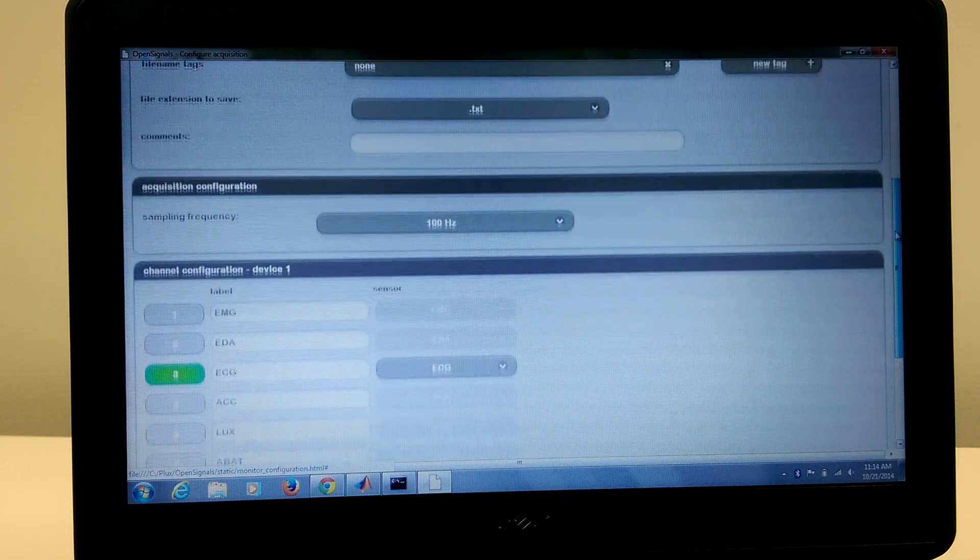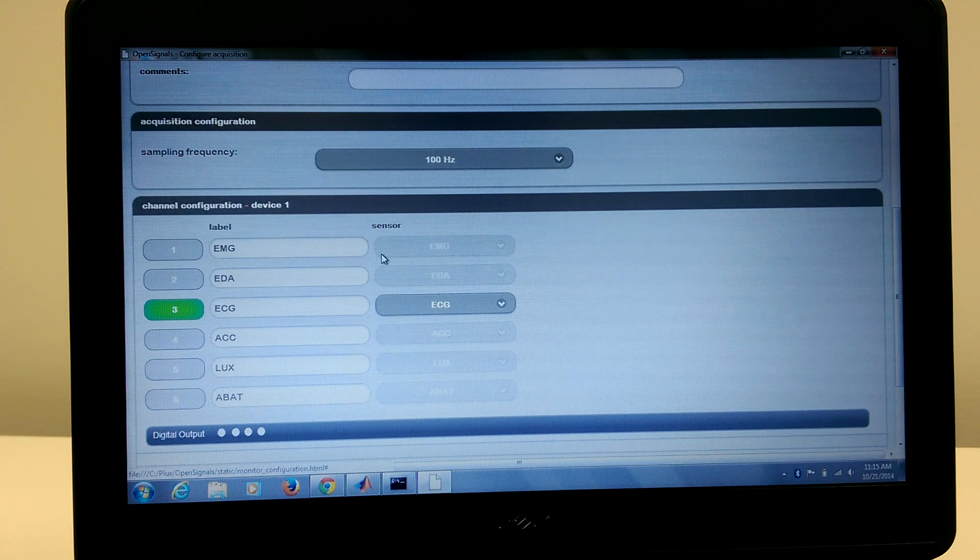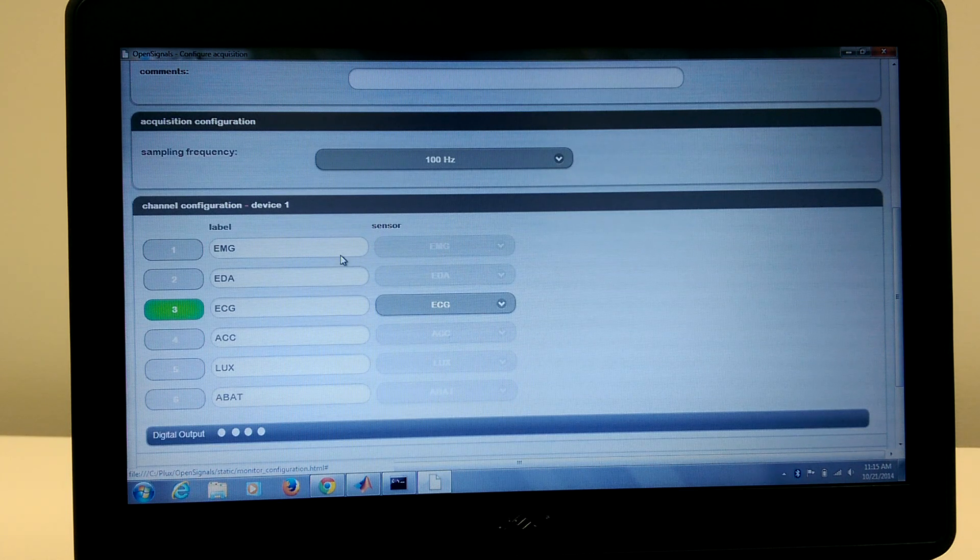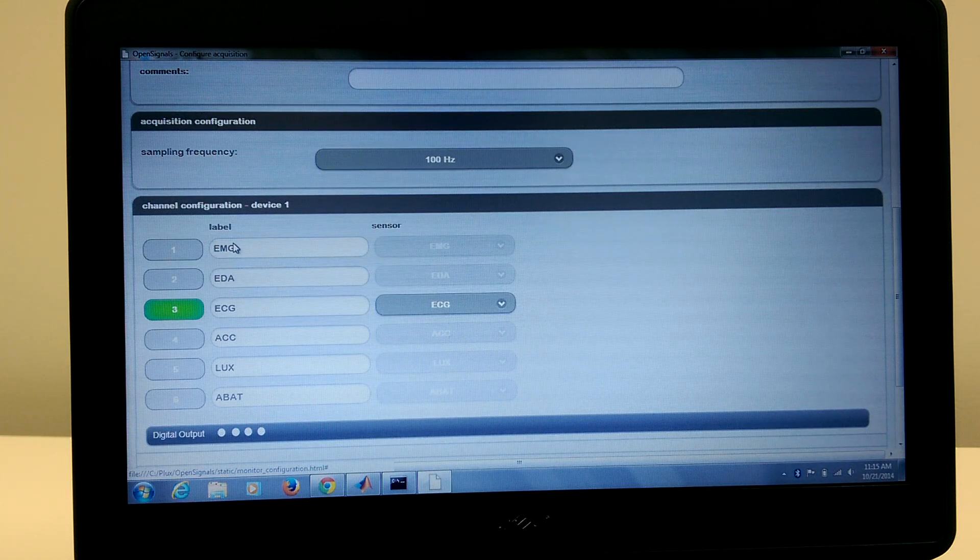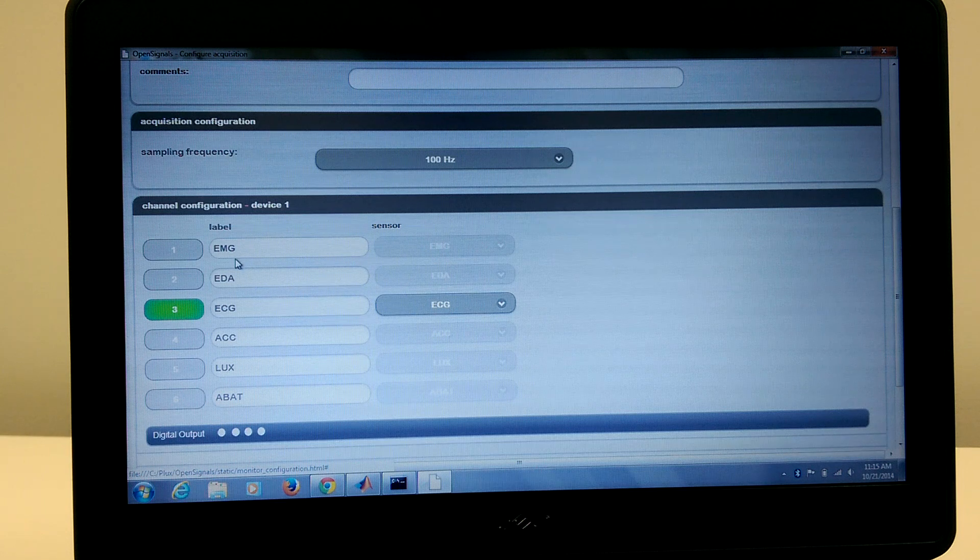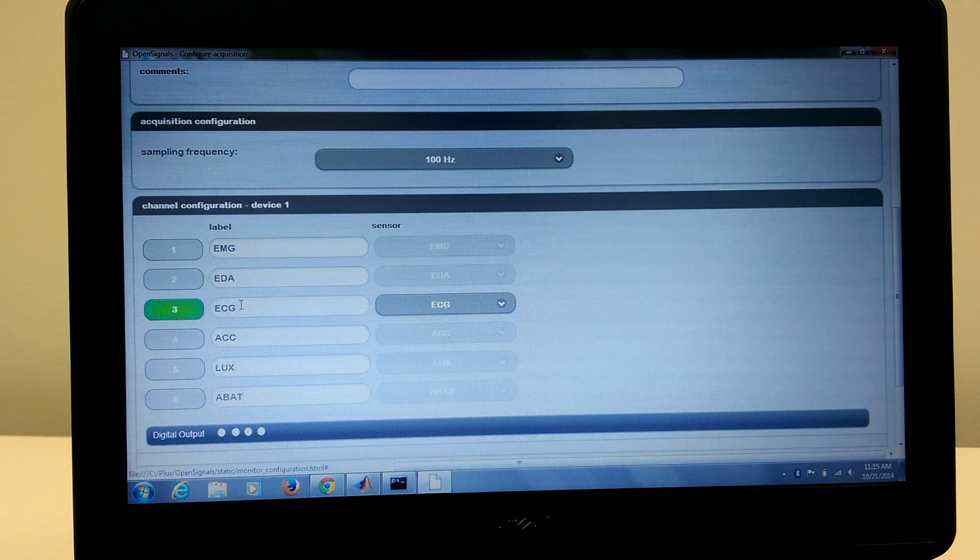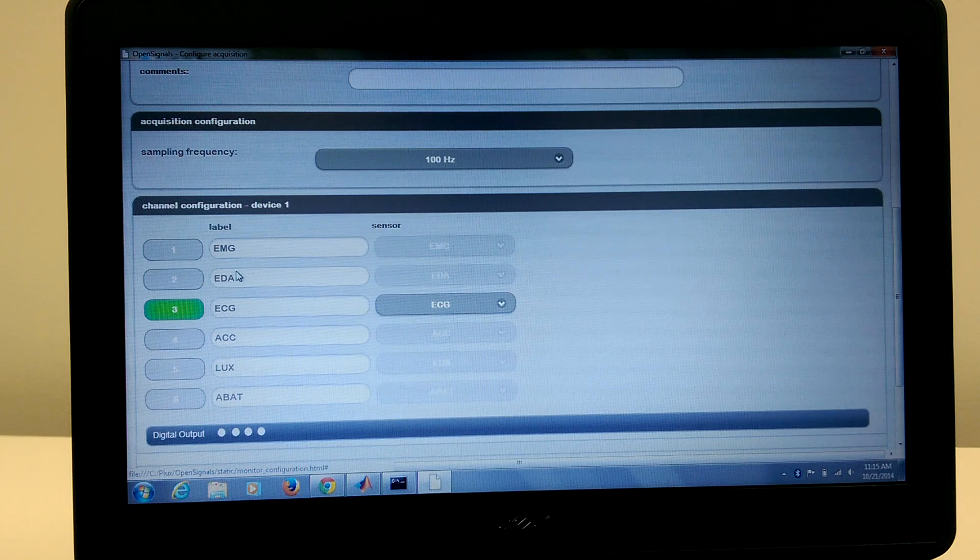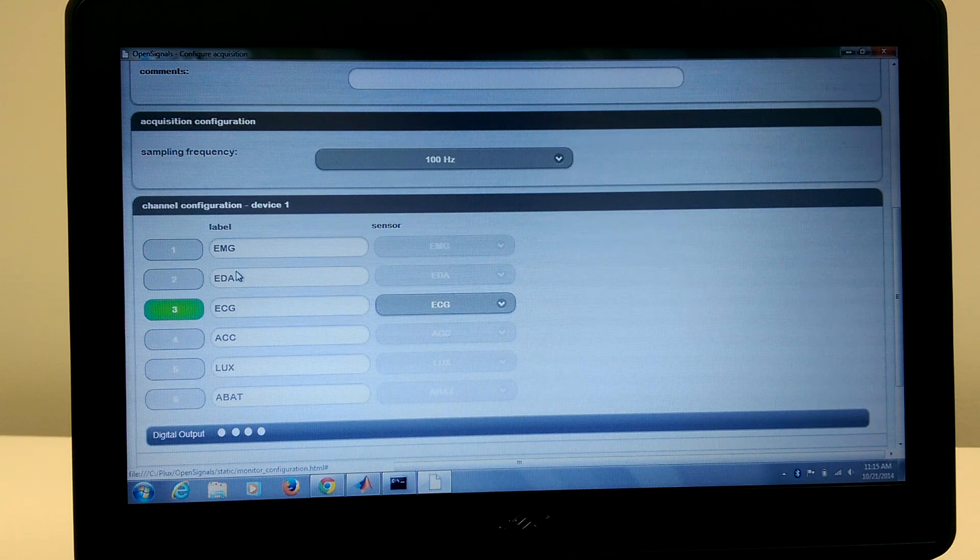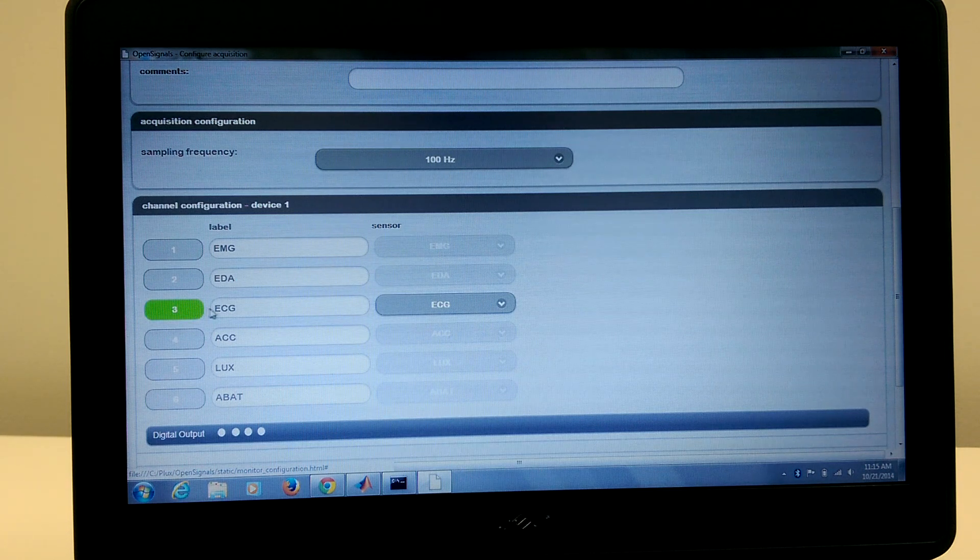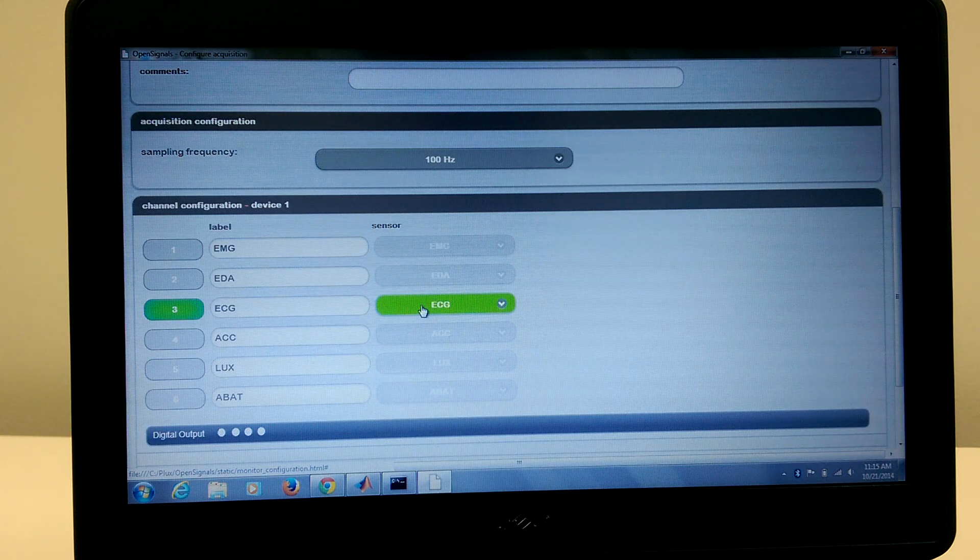And lastly, we have the channels. If you were using an older board, you might actually have to tinker with these because some of the labeling will be incorrect. So for example, the EMG might actually be the ECG, but it's labeled incorrectly here when you first download OpenSignals. In our case, it's labeled correctly. Channel 3 is the ECG and we have the sensor.